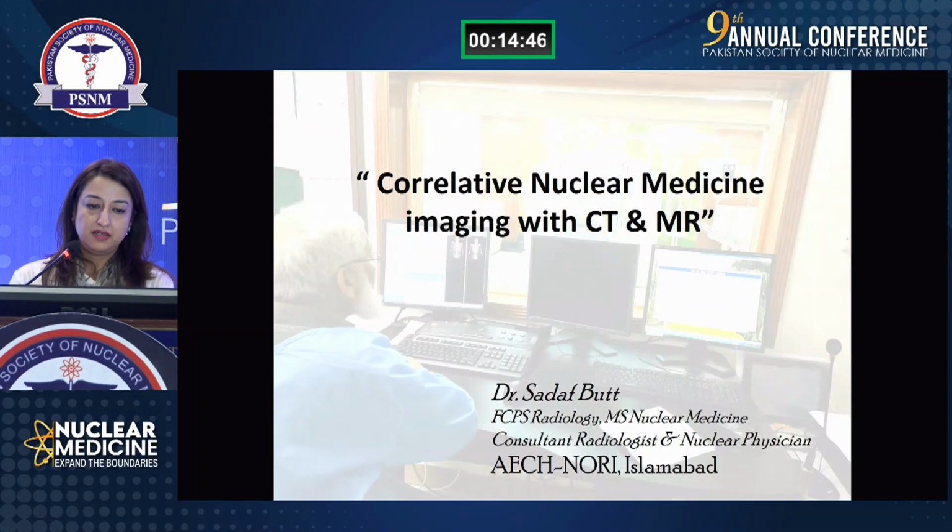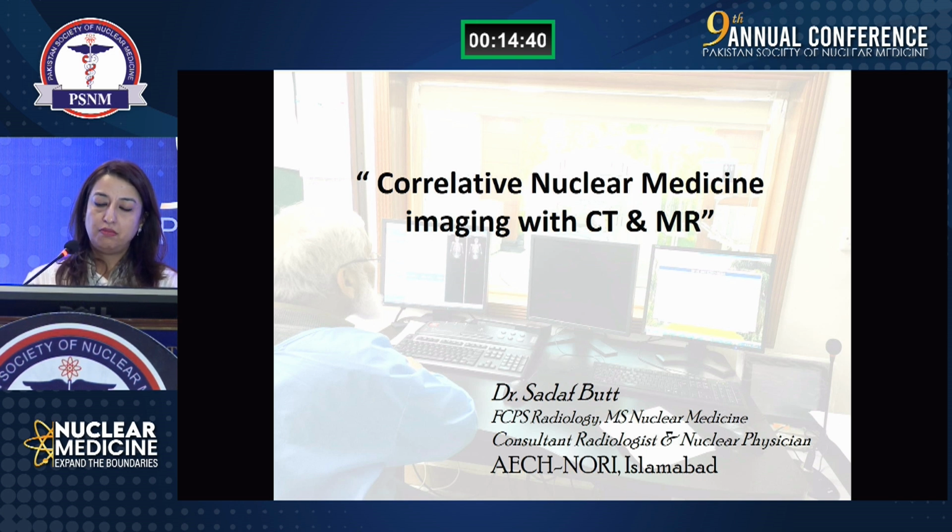Thank you so much, Dr. Zahir. Bismillahirrahmanirrahim. Assalamu alaikum. So yes, I'm a radiologist and nuclear physician working in Noori Hospital. And I'll be focusing on correlative nuclear medicine imaging with CT-MR, that is the cross-sectional anatomical imaging, and how it can complement the nuclear medicine imaging.